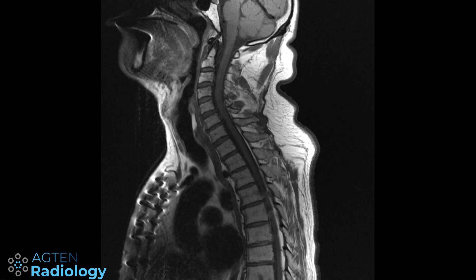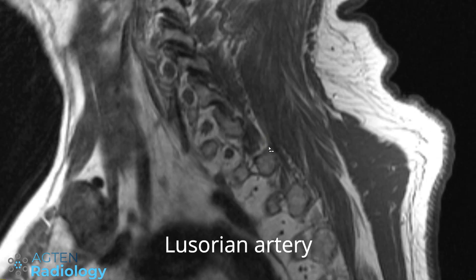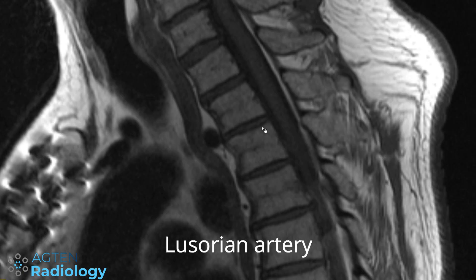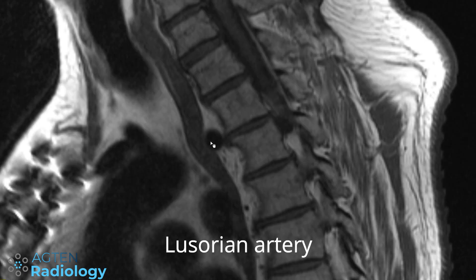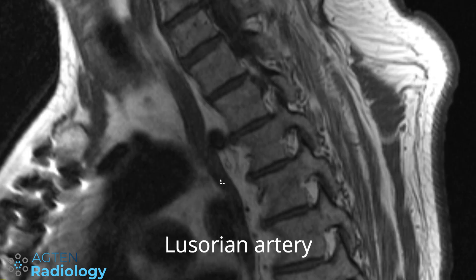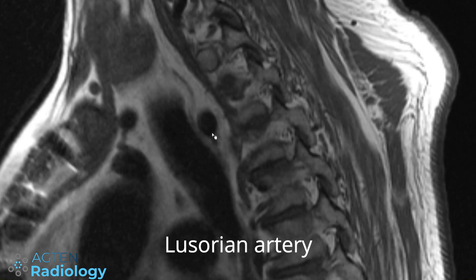This next incidental finding is a vascular anomaly you can sometimes see on your C-spine or thoracic spine MRIs. It's an aberrant right subclavian artery, also known as a lusorian artery. You can see here a very large vessel running behind the oesophagus from the aortic arch to the right side.